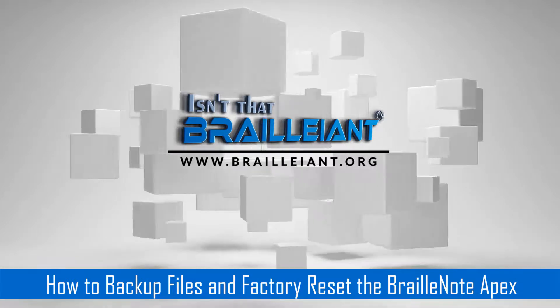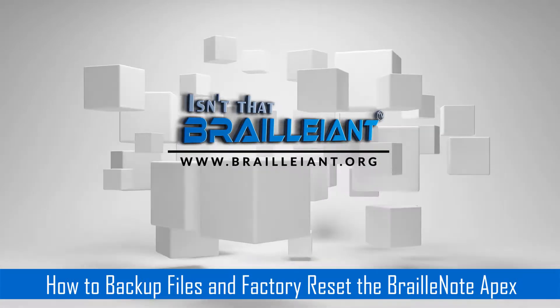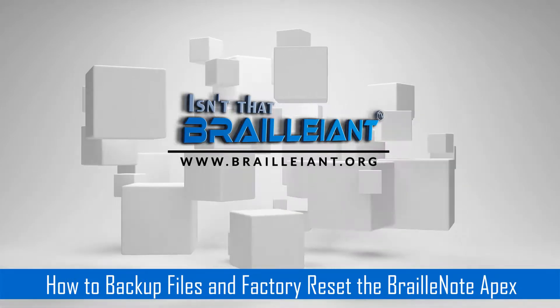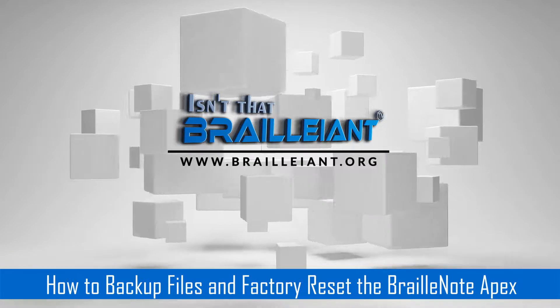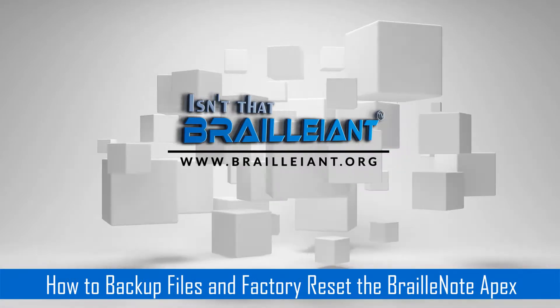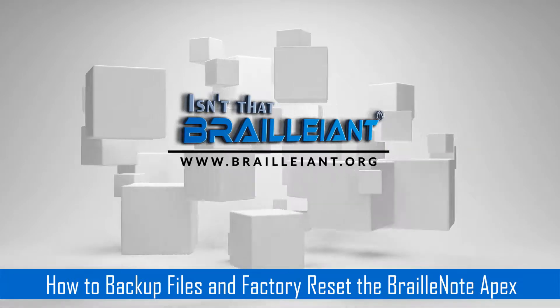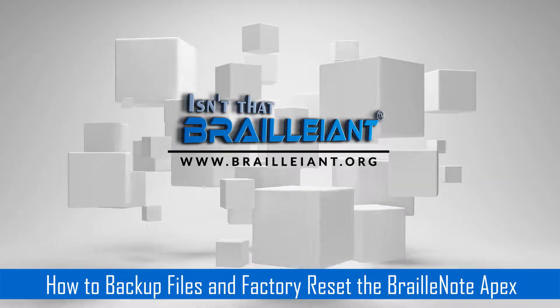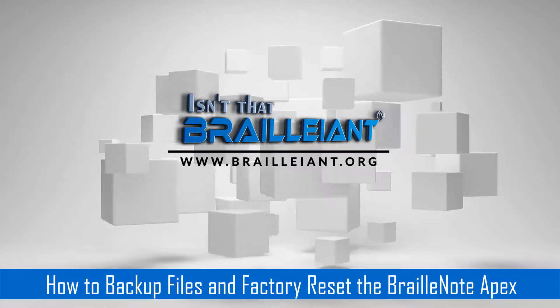The first thing I'm going to do is plug in a flash drive. When I do that, the BrailleNote is going to prompt 'Hard Disk Ready.' As you heard, it said Hard Disk Ready.